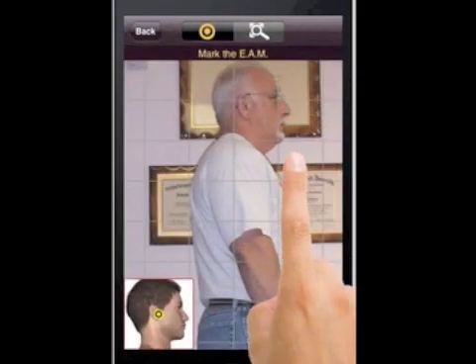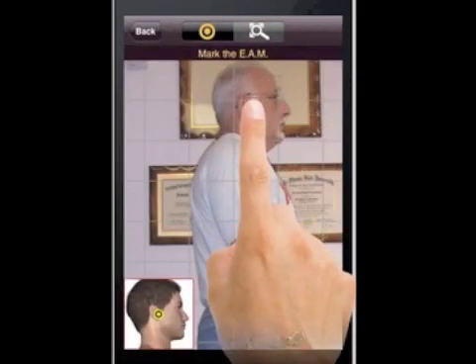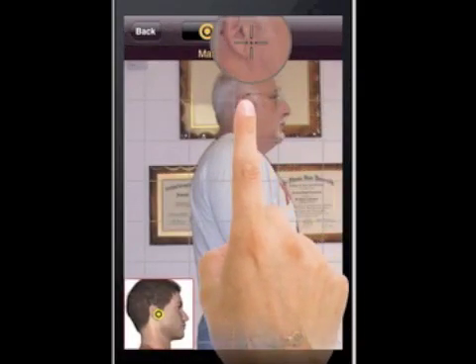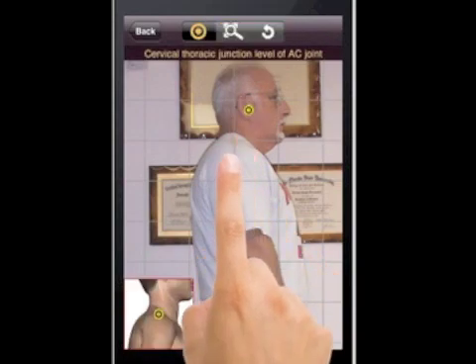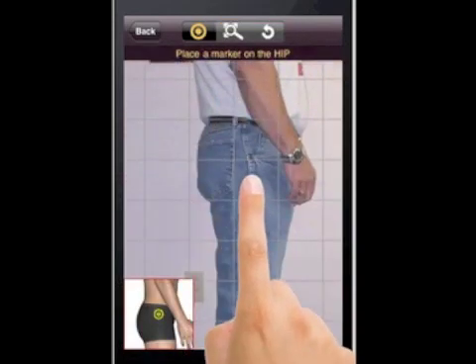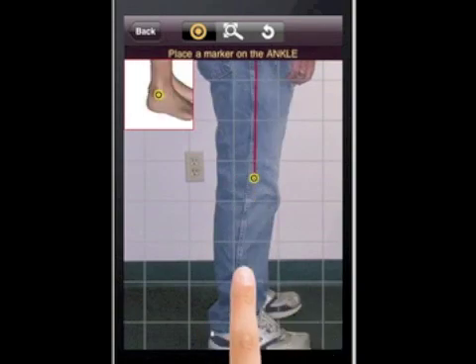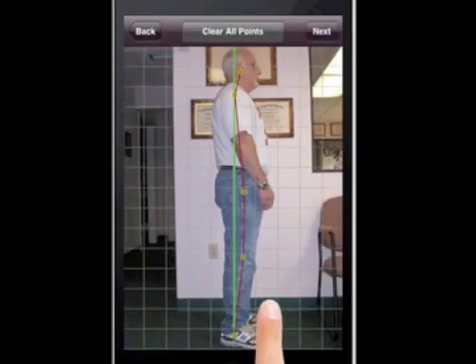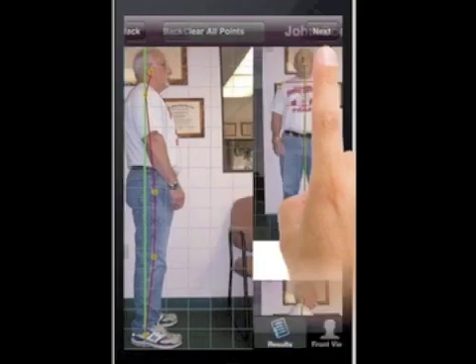We're going to do the same thing for the side view. Notice that the grid is superimposed over the image. We're going to go mid-hip, mid-knee, and ankle. And there we're done. Now we're going to hit Next.